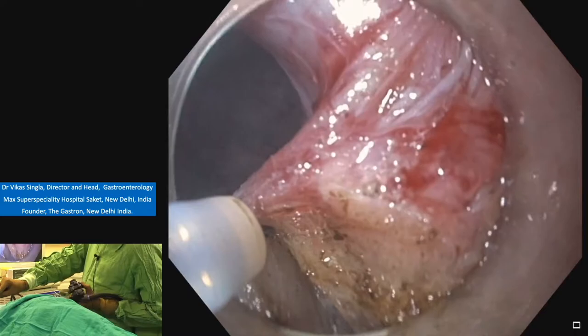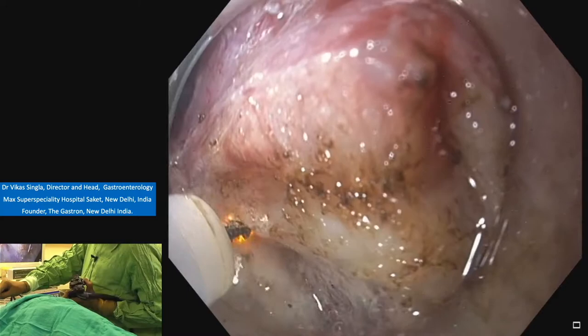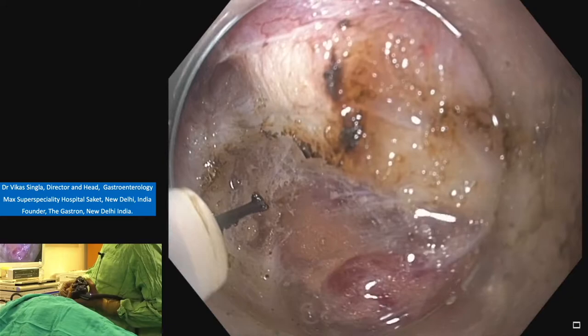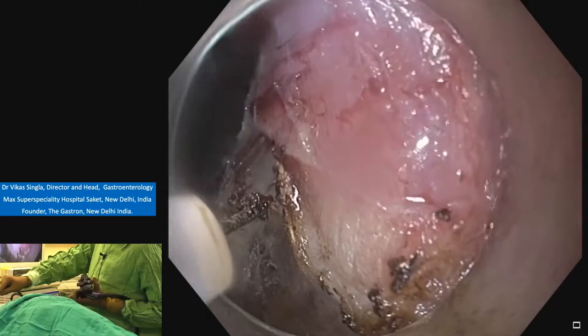I think it's a complete myotomy. Yes. Again, we can see the adventitia below. Lift it, lift, and then coagulate and then cut. We can see cut is very fast and very clean, but it can cause more bleeding. And here we can see the perigastric fat. Very carefully do the myotomy and if there is a bleed, at the same time you can apply coagulation current with the knife only.